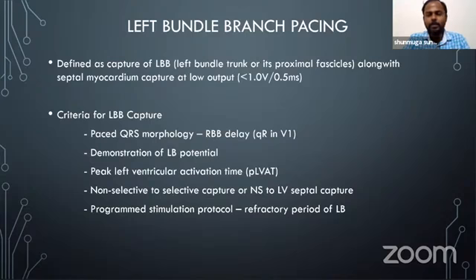One is demonstration of the left bundle potential. I've shown that whenever you place the catheter across the His-bundle, you'll see three deflections. One is the atrial deflection, the second is the His-bundle deflection, and the third is the ventricular deflection.